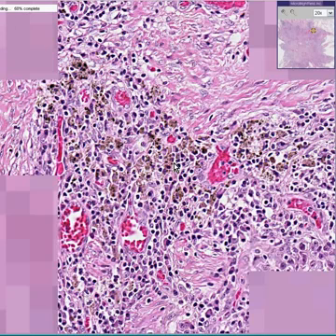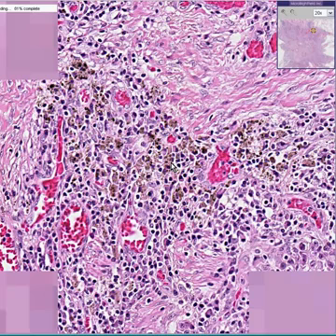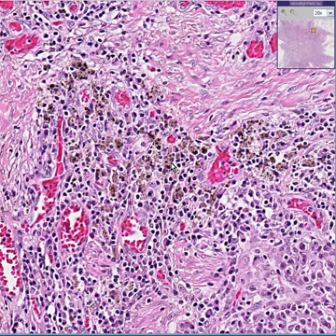Now, if you ask me, could this be melanin? I would have to think, well, maybe. If you say, could this be anthracosis? I'd have to say no, because anthracosis is pitch black. If you say, could this pigment be tattoo? I'd have to say no. People don't get tattoos in their lungs, especially lung tumors. Plus, it's not black enough. If you say, could this be lipofuscin pigment? I would say no, because that's only in viable cells that are aging, like the heart. If you said, could this be bile? I'd say, well, you shouldn't normally have bile inside of a lung tumor, should you?